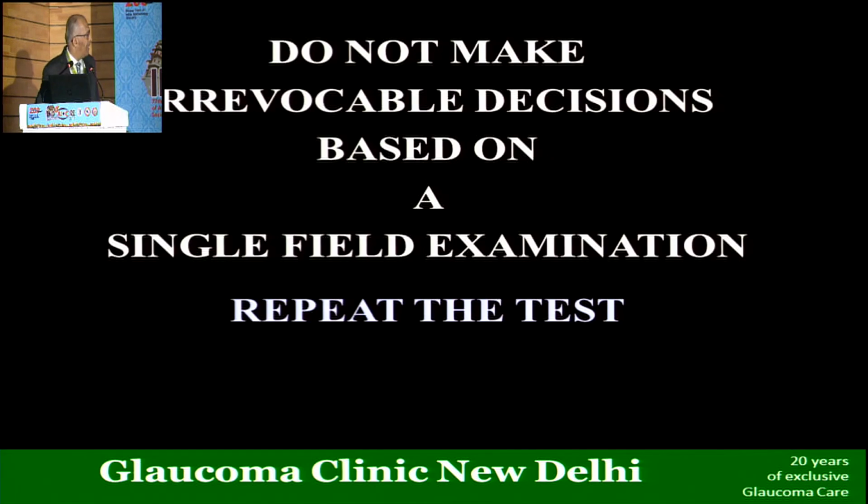So just to emphasize, do not make a decision based on a single visual field examination. If you have a doubt, please repeat the fields.